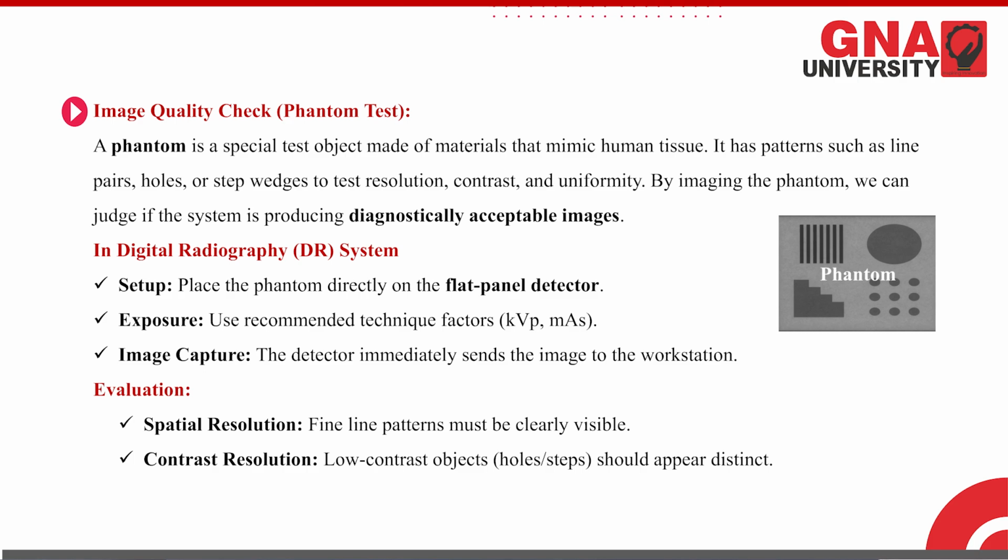Lines are there, holes are there, and various steps are there, and these things help us to recognize whether my resolution is maintained properly, whether my contrast is proper, and whether uniformity is maintained properly in the image. We can check it with the help of this phantom, and by imaging the phantom we can judge if the system is producing a diagnostically acceptable image with high accuracy and high quality.